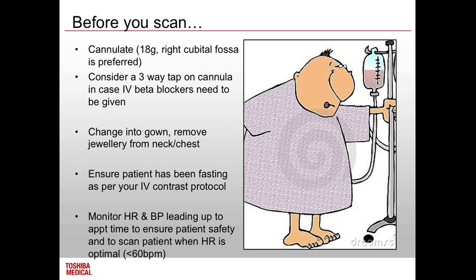If you've got a CABG patient, 90% of the time they'll use the LIMA because the left side lines up perfectly with the LAD, the left anterior descending, which you'll get to learn. Don't worry about anatomy for the heart. It actually gets really easy because it's all the same all the time. There are a few minor changes in a few people, but generally speaking, it's not hard. So the LIMA will come straight down and attach to the LAD usually.